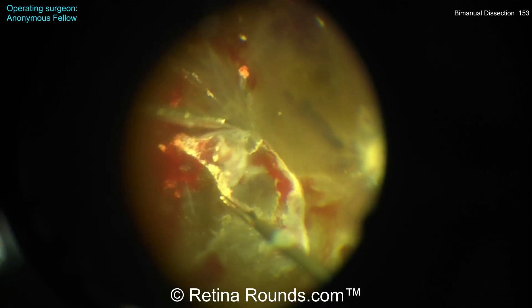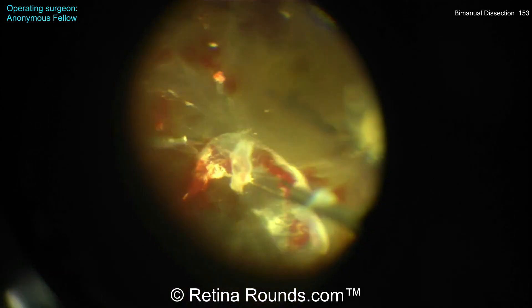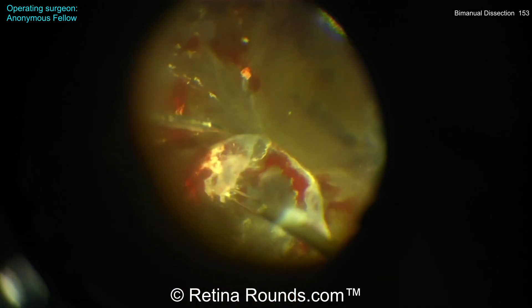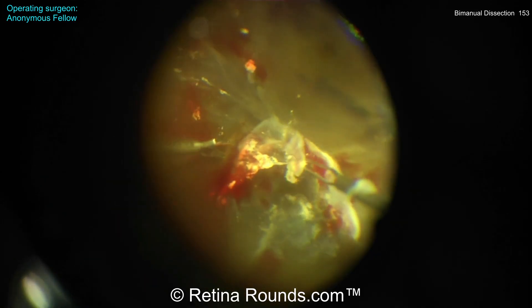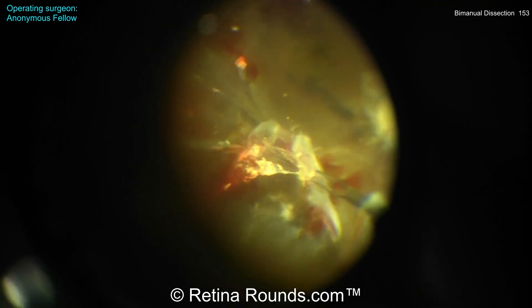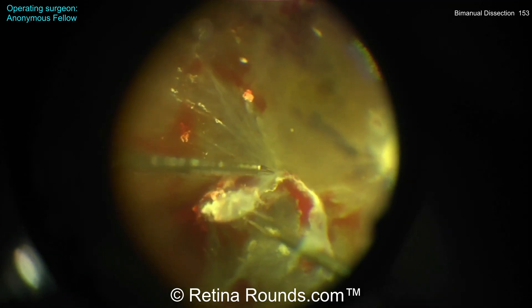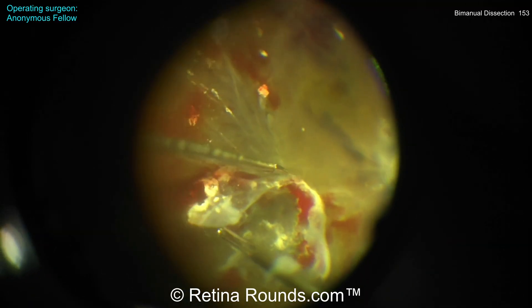Let's have a look at the dissection here. I'd like to see this as being more of a temporal-to-nasal approach rather than dissecting along the posterior edge of this fibrovascular membrane. I think it'll make it a lot safer, a lot lower risk for creating an iatrogenic retinal break, and a lot more efficient as well. Rather than pulling posterior-to-anterior, I'd like to see this membrane being pulled more temporal-to-nasal.